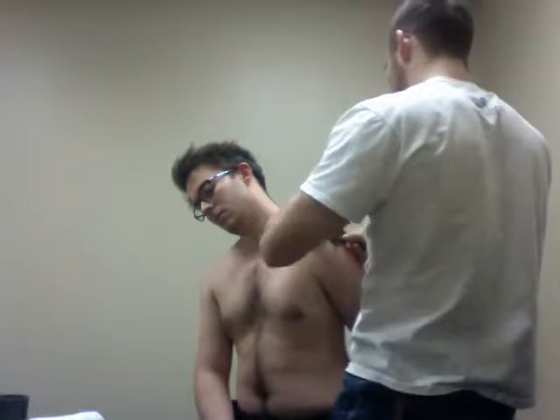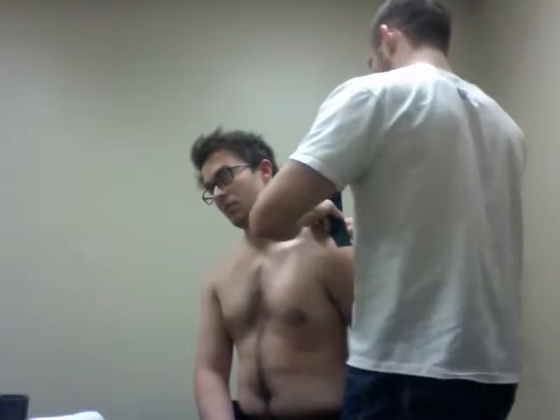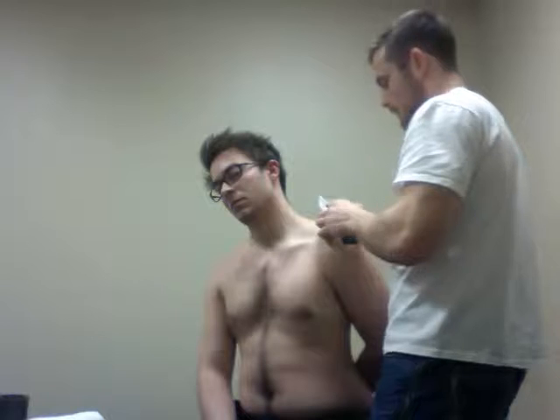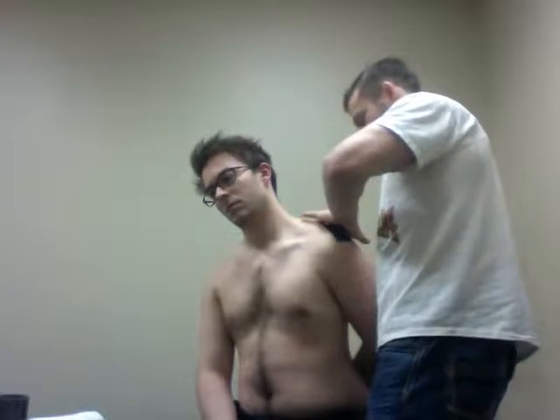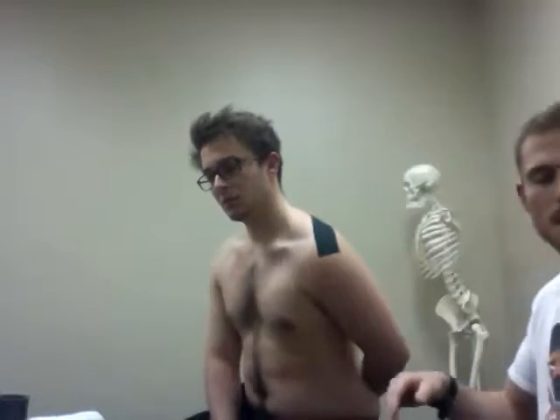I go here — essentially what I'm going to do is follow down the supraspinous fossa. Tension-off tape, following the origin insertion of the supraspinatus.